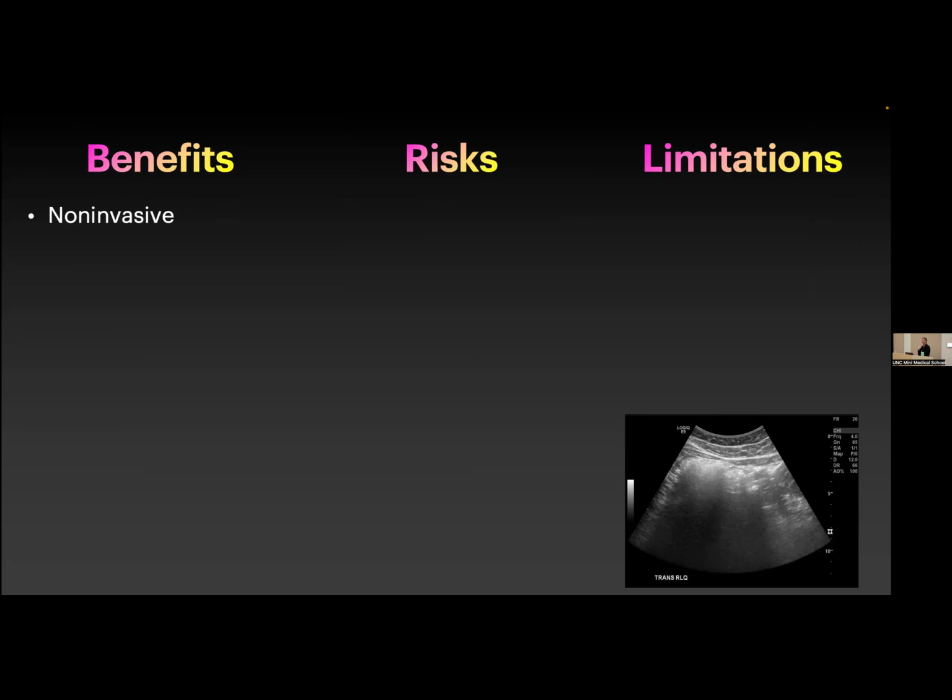So why is it great? It's non-invasive, right? We are just taking pictures from the skin surface. Widely available, pretty much available almost everywhere. Or if you don't have it available, you can take a butterfly probe with you. And it's easy to use. It's typically less expensive, and I'm going to run through this quickly because I know we've already gone through some of this. I'll expand on a few of these points.